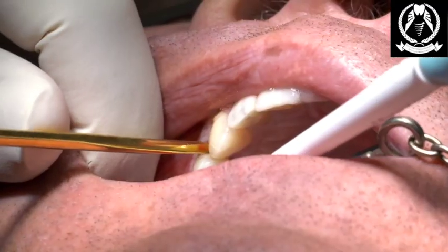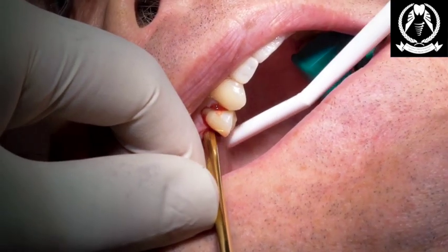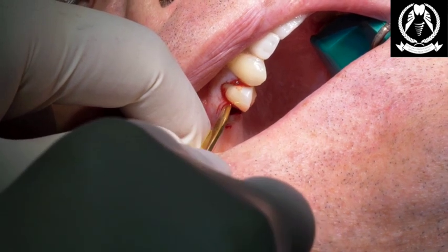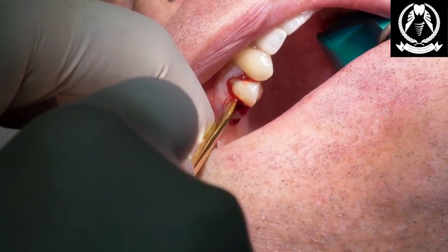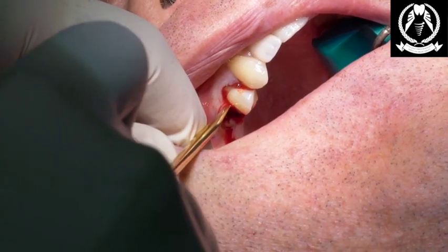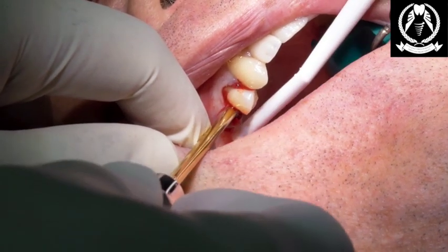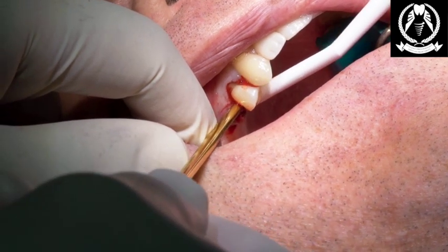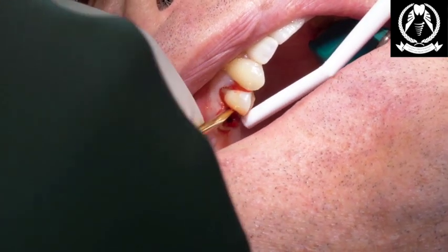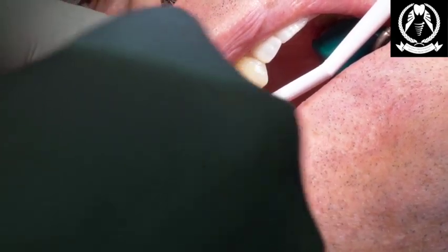Yeah, that's the one. And we're just going to put some more pressure here. The way we do extractions now is by time and patience, because when you place pressure on a tooth, the PDL will actually release hyaluronic acid, and that acid will help release the tooth. It's very important when you're doing implants that you extract the teeth without damaging the surrounding bone of the socket. So we want to use that valuable alveolar bone, because once that alveolar bone goes, it never comes back, right? So we can already see we're getting a little bit of movement.